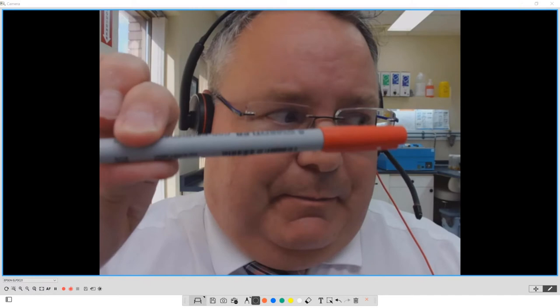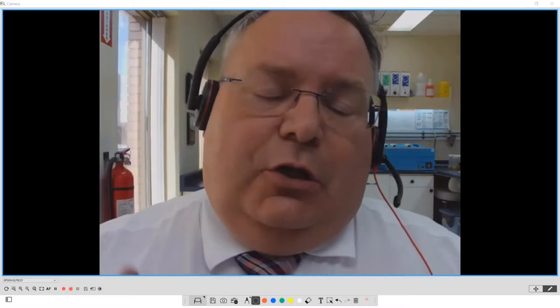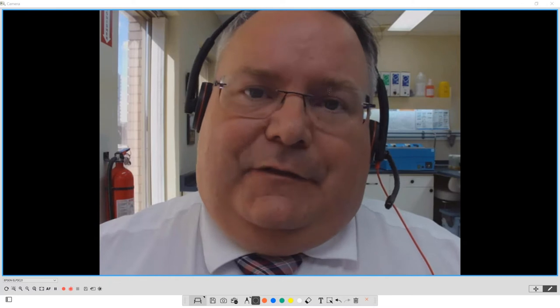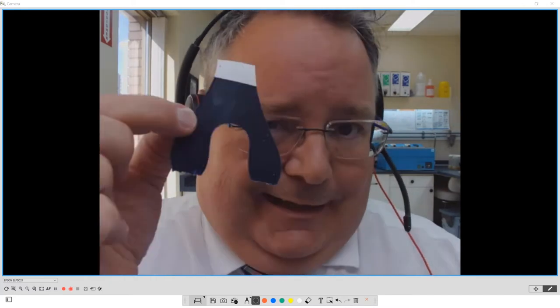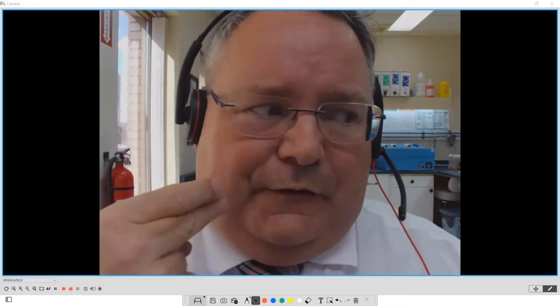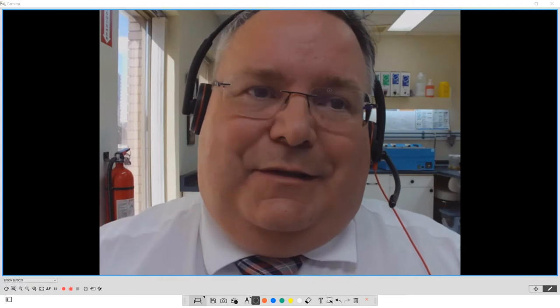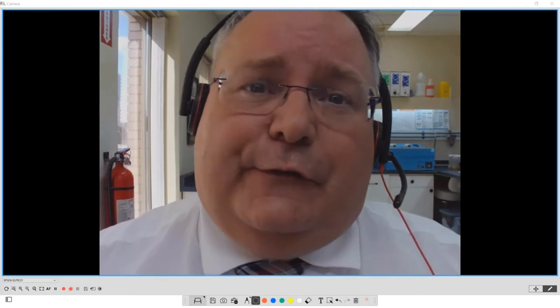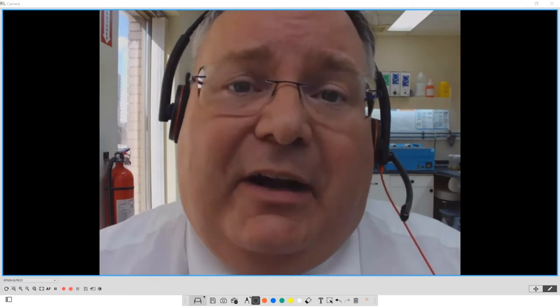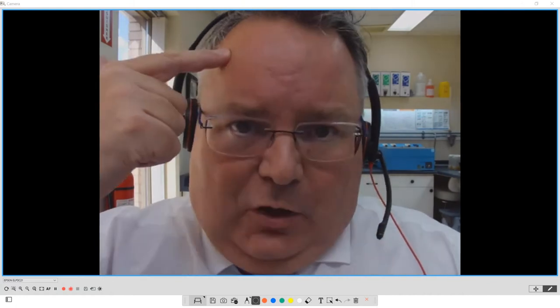I use the pens. I use a swab for clinical side, chairside. Get your hands off the person. Don't manipulate the data that they're trying to give you. Don't stick articulating paper in their mouth. It changes the position of their bite. Don't use the forceps to go in there. It changes the position of their bite. Don't get them to think. Stop using the words close or bite. Use the word swallow. That is a subconscious command.